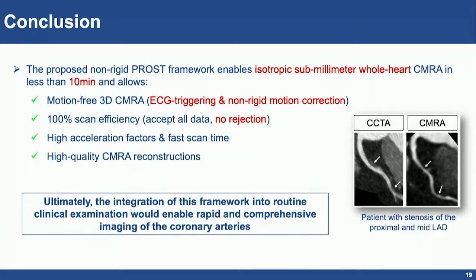Now we have one goal in mind, integrating this framework into clinical examination, which will enable rapid and comprehensive imaging of the coronary arteries.